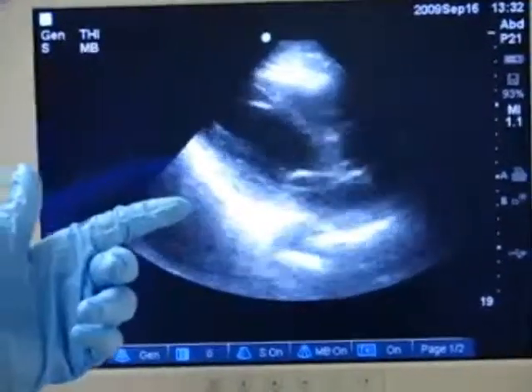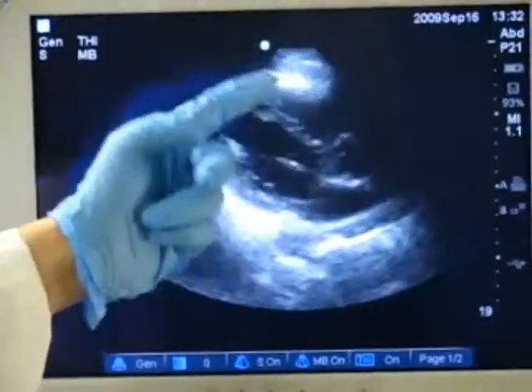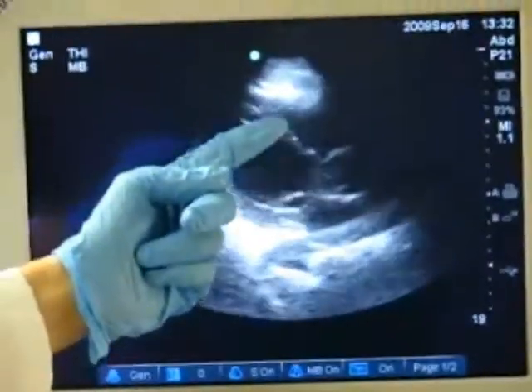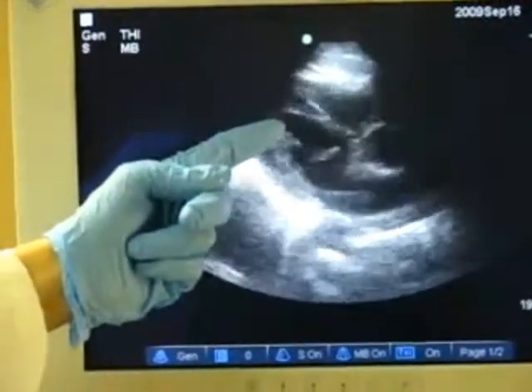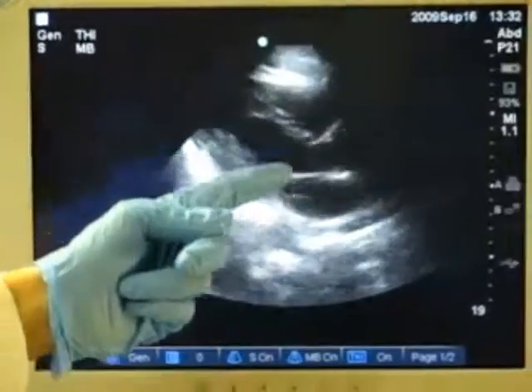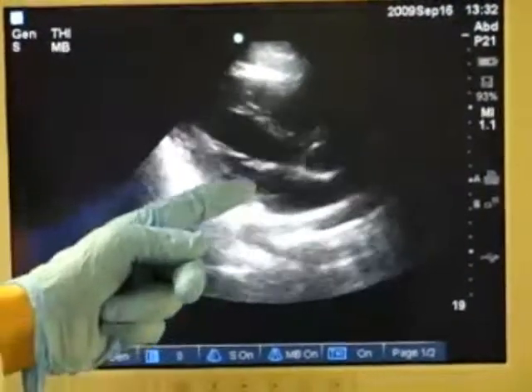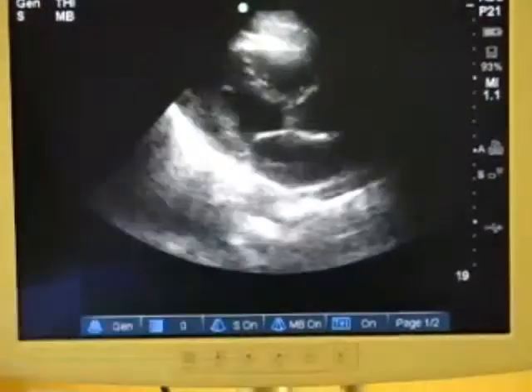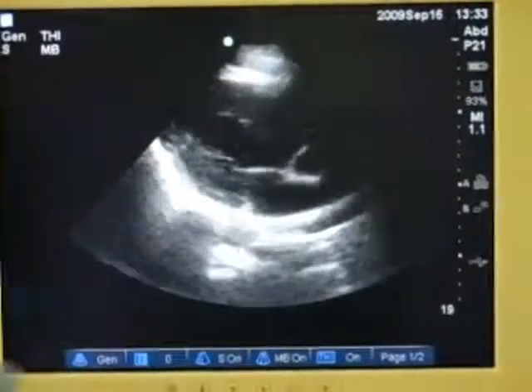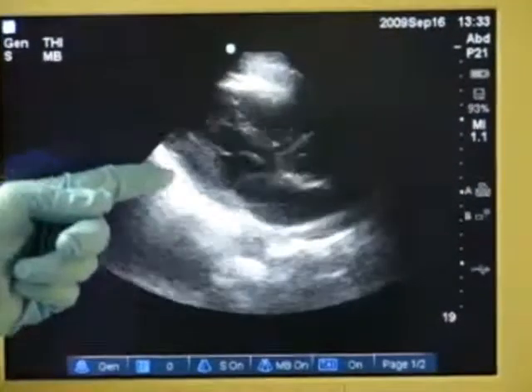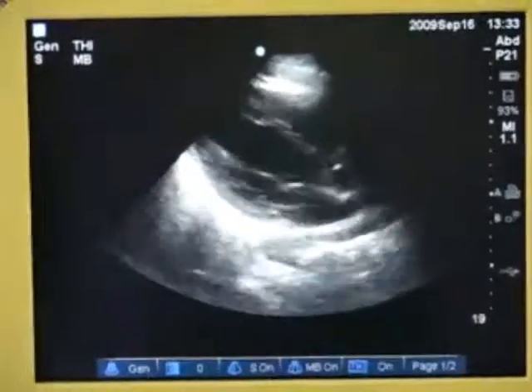Looking at the screen now, what we see is the chest wall, the right ventricle, the left ventricle, here is the aortic valve, here is the mitral valve. A quick assessment can be made to see if there is any evidence of pericardial fluid, posterior to the heart.